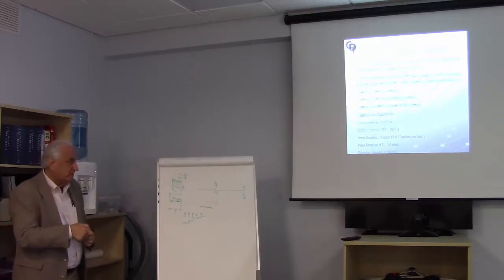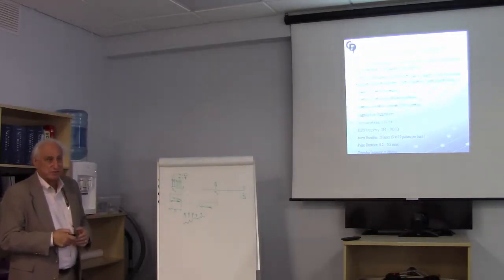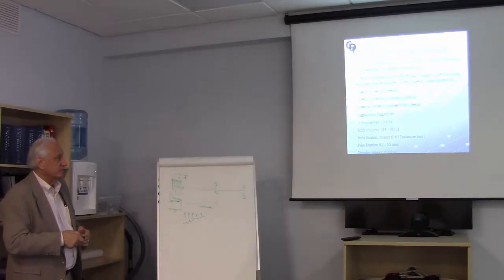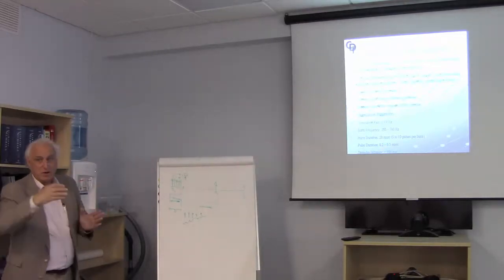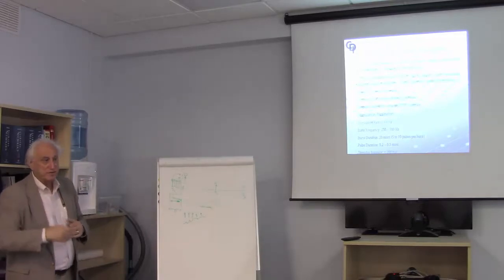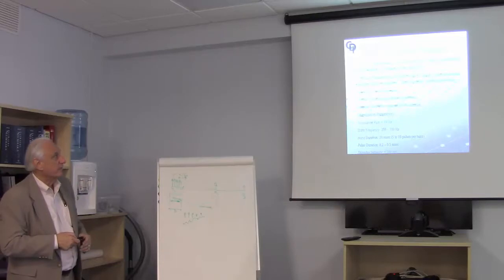I don't know why you would ever need to do that. We typically are stimulating around 100 milliamps, most patients, with a pulse width of 200 microseconds, 0.2 milliseconds. So I don't know why people need those huge values. So the stimulation parameters are extremely important.